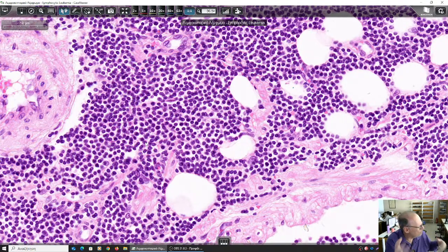These are B cells, CD19 positive, CD20 positive. There is another immunohistochemical staining: when we have a B-cell population which expresses immunoglobulin, under the condition that it expresses immunoglobulin, it may help us define its clonality. If there are B cells that are mature enough that they express immunoglobulin, either plasmacytes or somehow mature, not being plasmacytes.